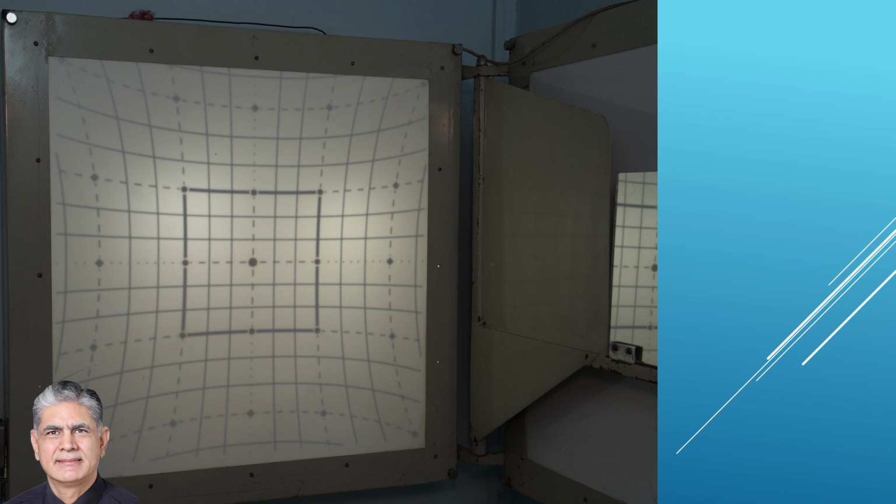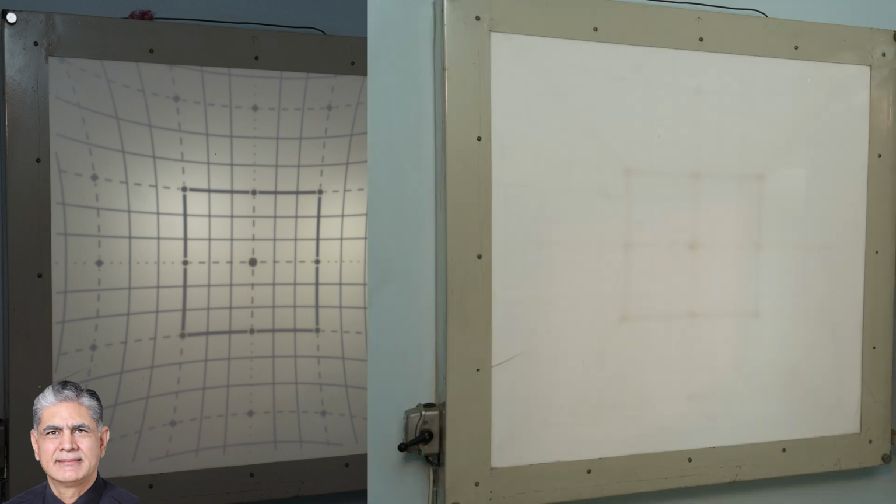This is the Hess test, and there is a grid on the white acrylic sheet at the back of that acrylic sheet, and that grid is not visible when there is no retroillumination. When we open the light, this grid is open to us. Using this Hess screen over and over for the last 15 or 20 years, what we have noticed is that it has engraved some lines in front of that chart, and that was visible to that patient.